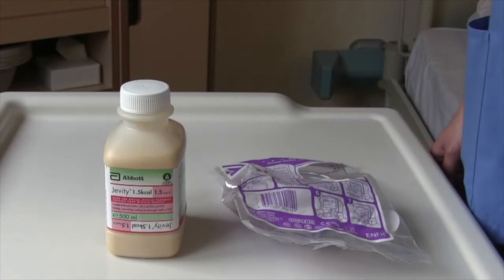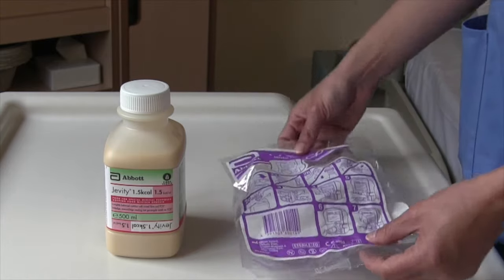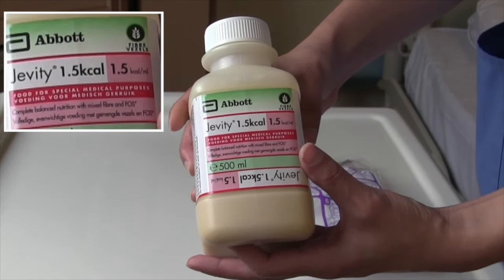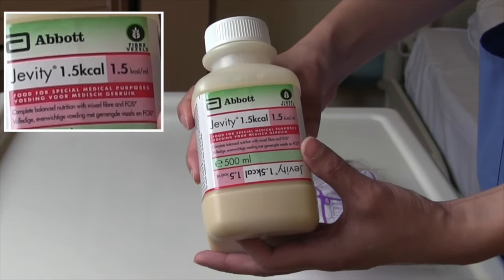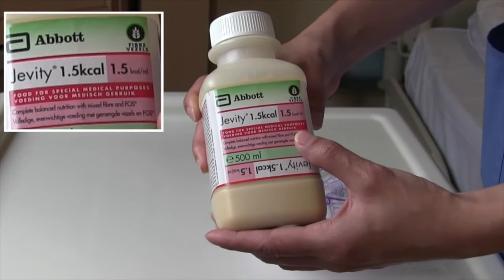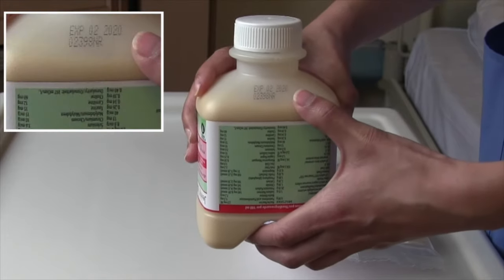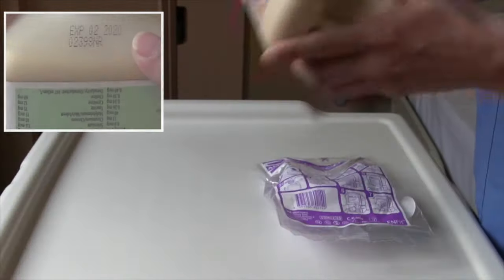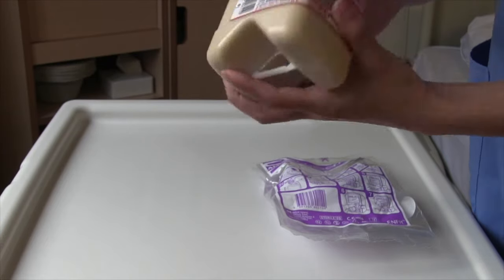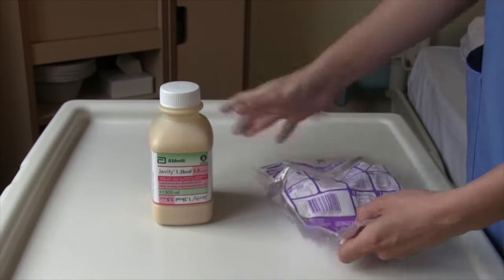Now we will go over how to connect your giving set to your feed. First, check the type of feed you are given by checking the name on the bottle. Your dietician will go over what type of feed you will be given and a feeding regimen will be decided for each individual. Check the expiry date to make sure the feed is within date. Shake the bottle to ensure the contents are mixed and there are no lumps or discoloration. If you notice this, discard the feed and take out a new bottle.